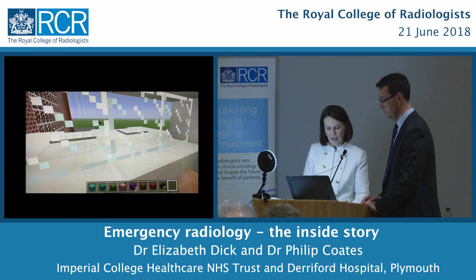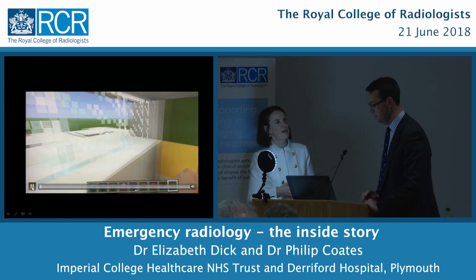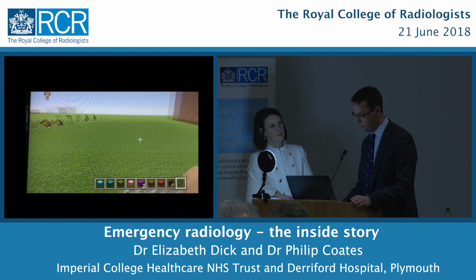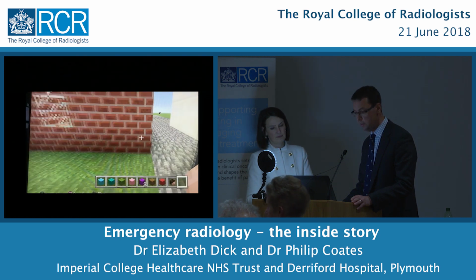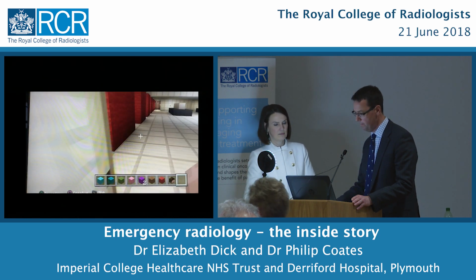Okay, so now, Phil, I think it's over to you because this next patient who's coming needs an interventional radiologist and you're the man. Okay, so we knew this patient was coming. He's potentially quite unstable. He's been brought through to the emergency department. We know he's got a high heart rate. He's got a left-sided abdominal pain. He's really quite unwell, so let's have a look at him.